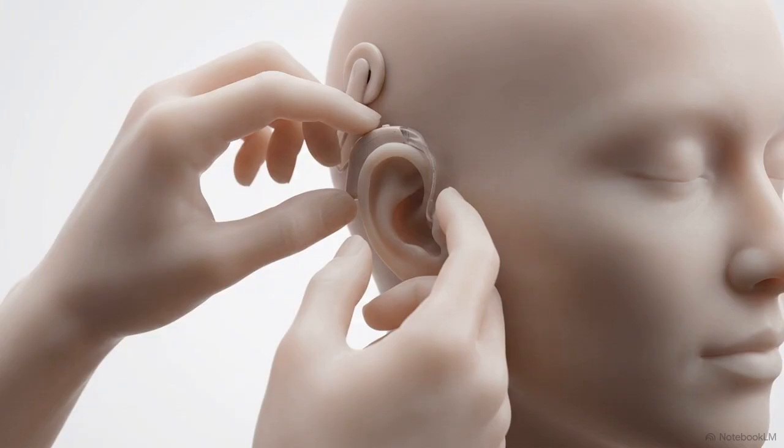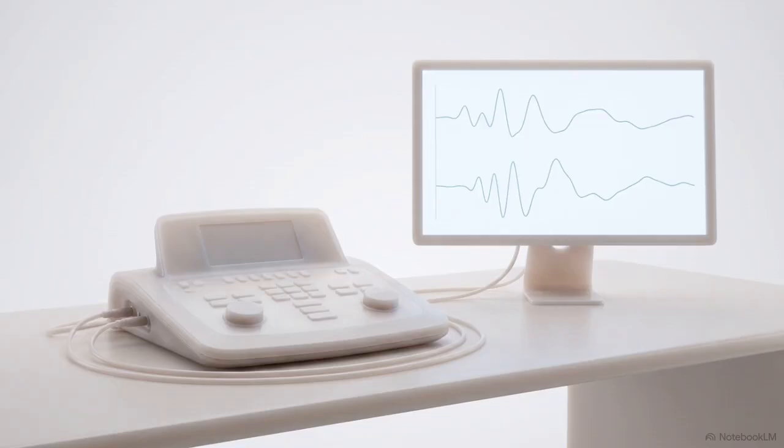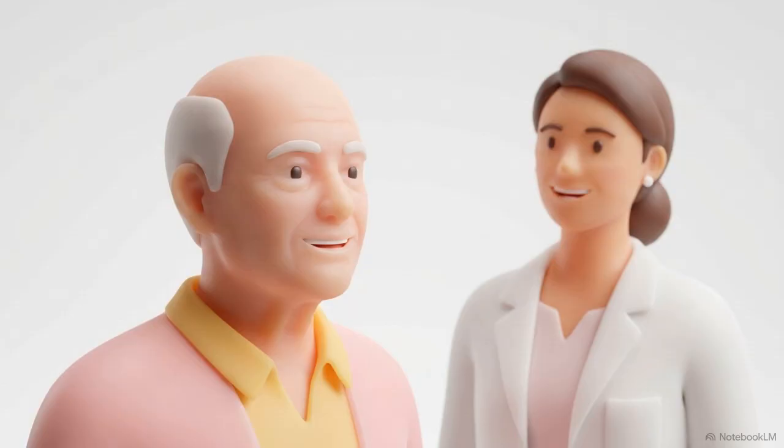This ranges from audiologists initiating early cochlear implantation for infants to neurosurgeons planning precise brainstem resections to preserve existing auditory function. Despite its limitations with microlesions, the auditory brainstem response remains the global gold standard in neurotology. It grants clinicians the tool to illuminate invisible neural highways, ensuring no vulnerable patient is abandoned to the silence of an undiagnosed deficit.